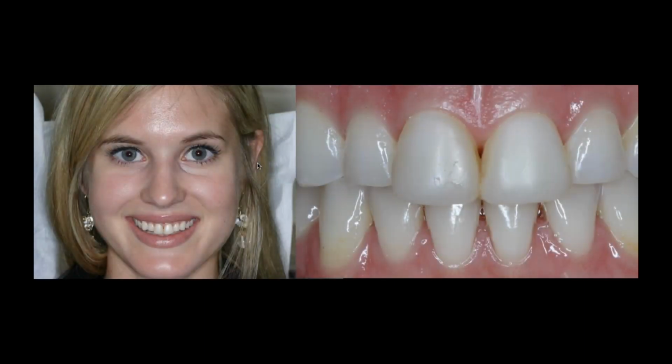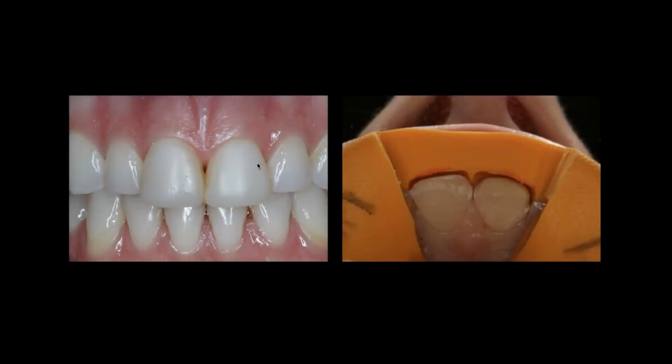So I simplify the two. For me, everything is about the internal opacity buildup and then finishing with the translucency or effect filtration that you need. And that works the same no matter what case I've done or how much space I have to work with.